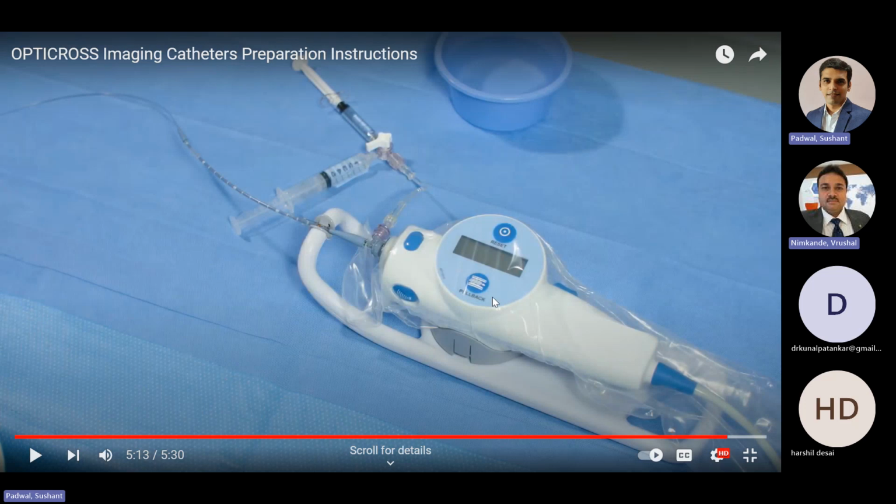They just see what length is captured there. You must have seen Japanese operators, they will not even ask the paramedic what is the diameter, what is the length. They will do everything on their own. In fact, the system is developed like that, so that an operator can do everything himself without asking anybody who is supporting on the machine side. All those features are provided in the system, so you yourself can capture the length, what is coming as per the angiogram, and everything is possible.